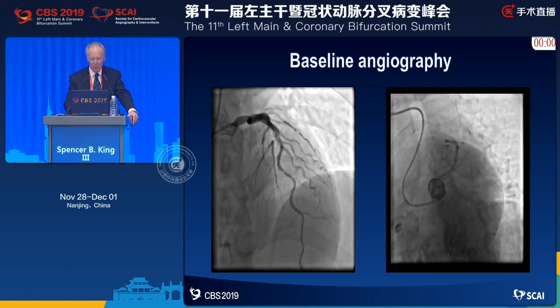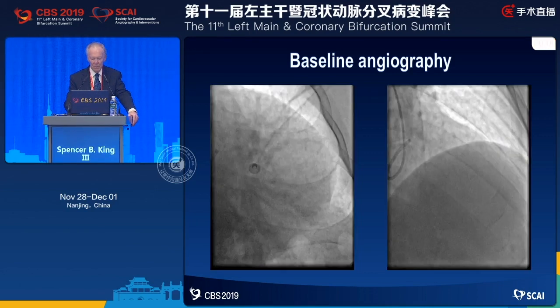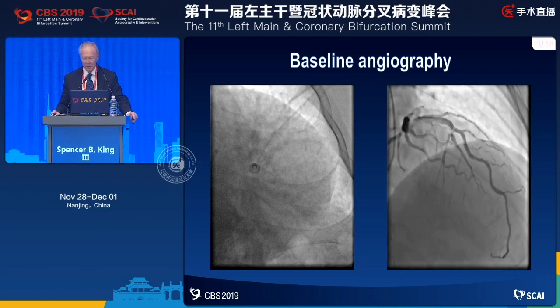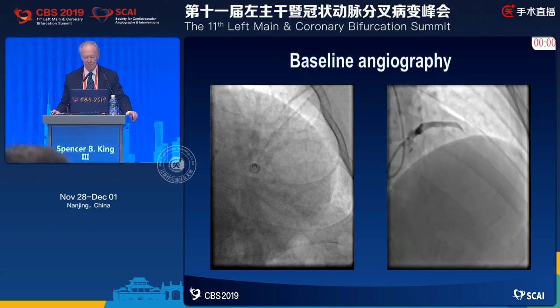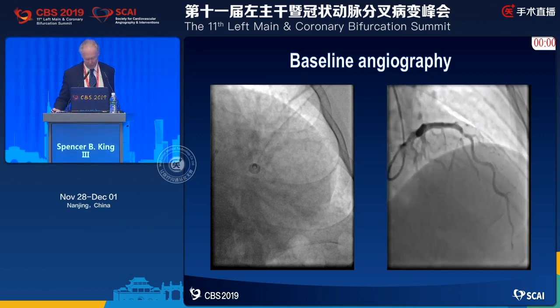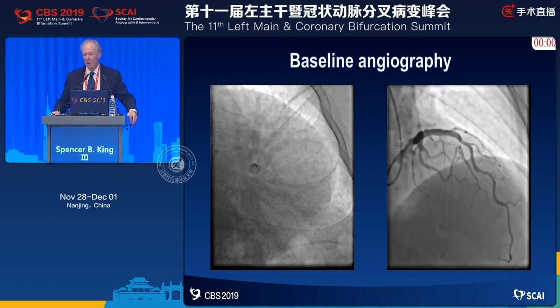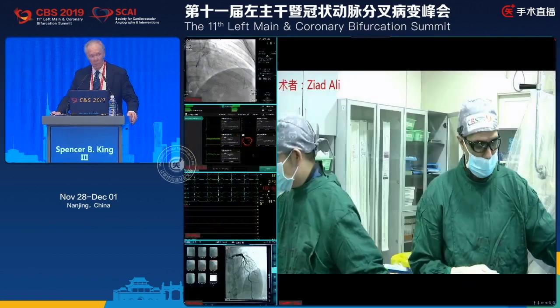I should try to go back. Very focal and moderate LAD, so definitely I think try to go back one more here. That's the best it's laid out. Yeah, the RAO view is probably the best in visualizing the lesion. Mm-hmm. Okay, then the question is, Dr. Ziad Ali, ready in that other room? We are ready.